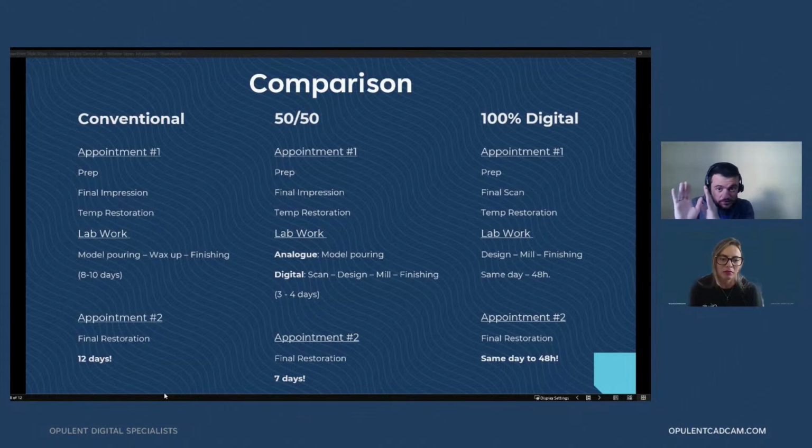So just on this basic comparison, we can think about the patient, right? I think we are all here as a business, but also for the patients at the end of the day. So imagine if you, as a patient, have to go this Monday, and then 2 weeks from there. Imagine if you're traveling to see a dentist, going back and forth, 2 weeks can be a long time. Imagine if you have the option of doing 1 to 2 days, or imagine if you, as a lab, can provide your doctor this possibility, so they can provide this to the patients. I think that's the point of the whole digital, right? To provide these flexibilities. Provide the options.